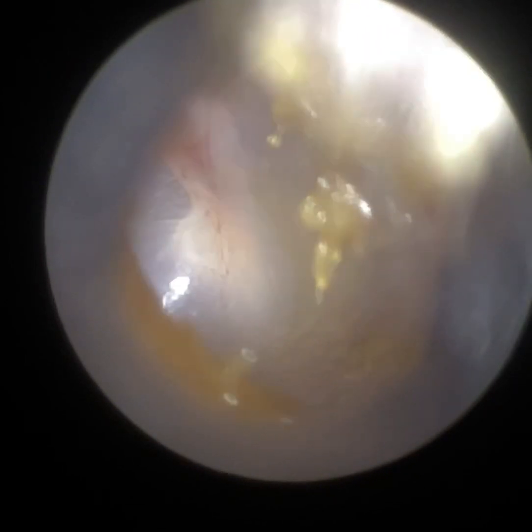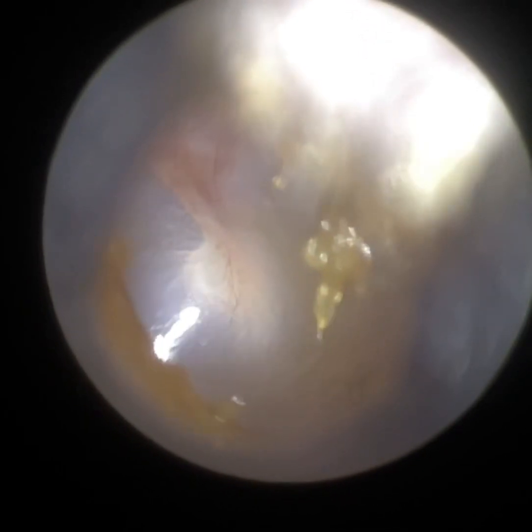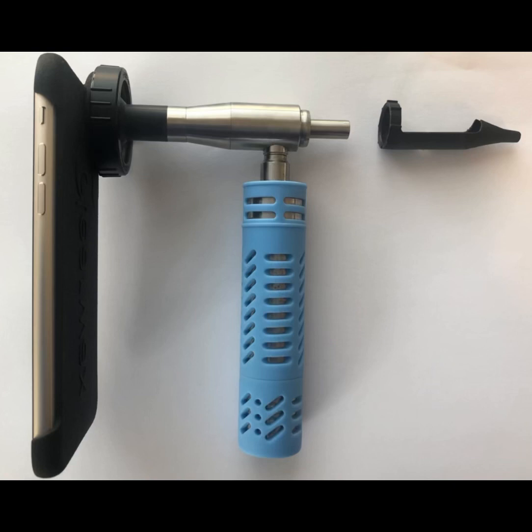Then we're going to focus in on the eardrum so you can have a good visual of it. And this is what's great about the Waxscope — if you change focus, it's really simple, it's just a swipe on the app. You can just see how clear that is. We can see all the blood vessels on the eardrum. There's some residual sticky wax here and there, but that's not significant.